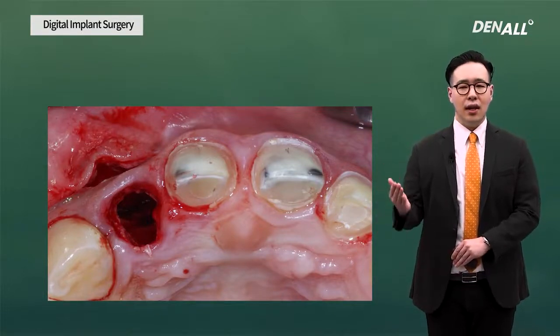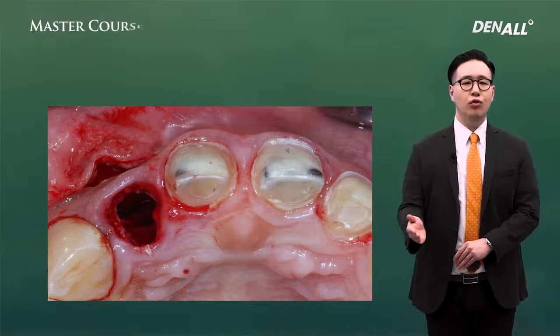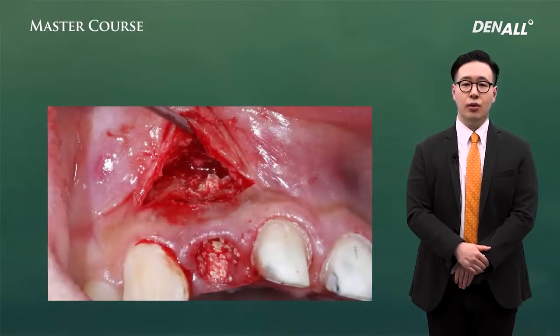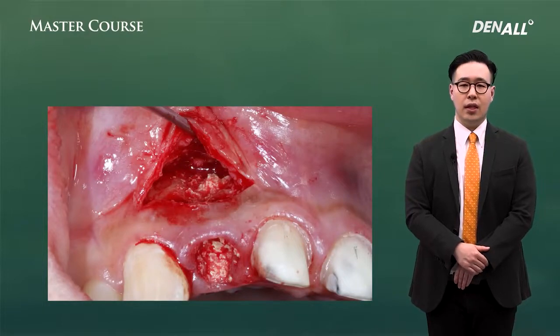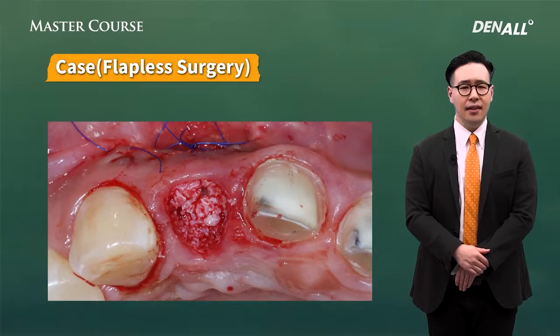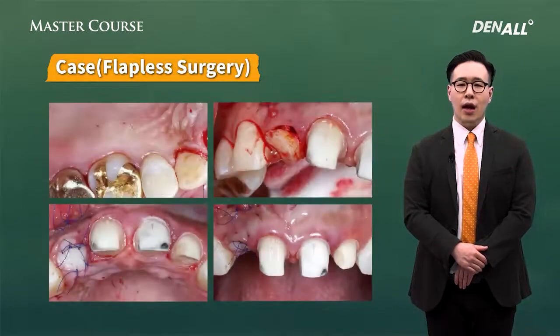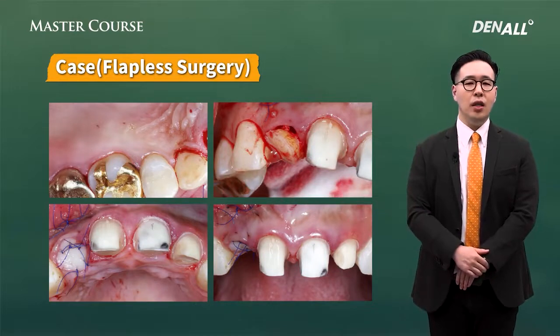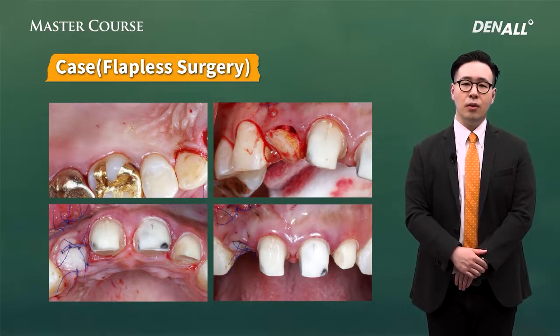Along the scar line, a flap is raised and the inflammatory tissue is removed. Socket preservation is done and the flap is closed. If the plan is not for immediate placement of an implant, the socket sealing technique using a round FGG will help for immediate support of the papilla and marginal gingiva.